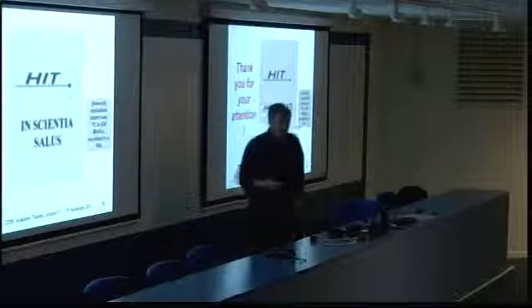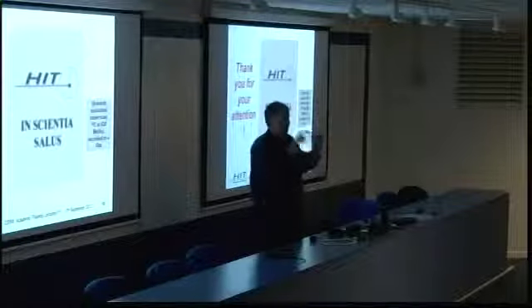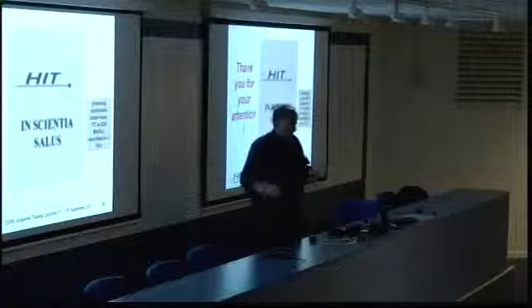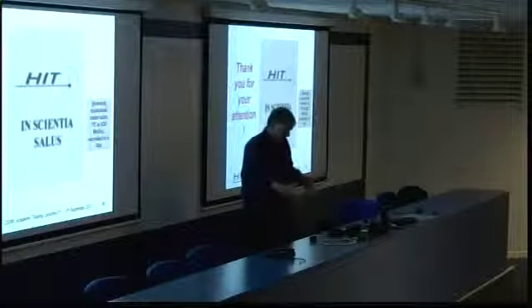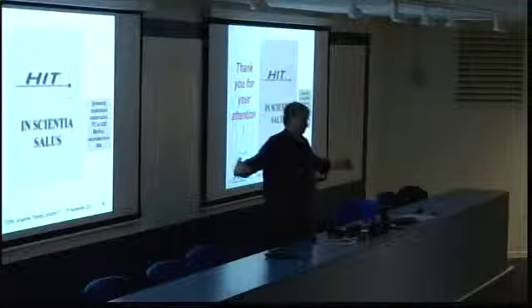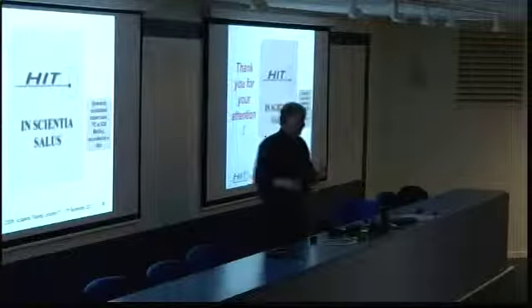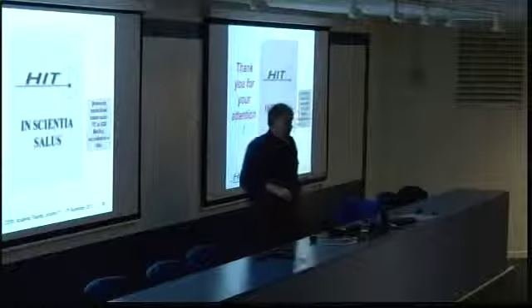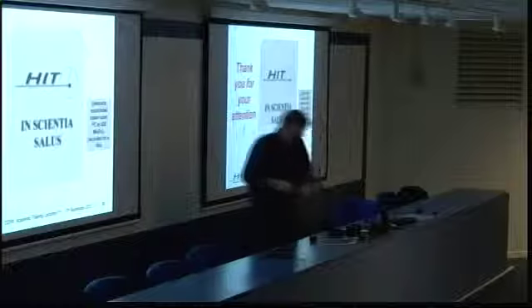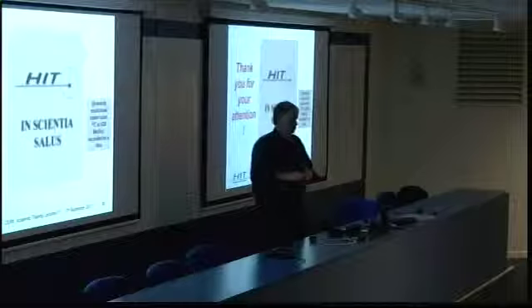The second story is the mechanical stability of such long, small and long things. Going back to the Linac, the IH drift tube Linac is very slim. It's only 40 centimeters in square and 4 meters long. Such structures tend to be weak and to not stay within 50 micron or something like that. As a gantry you may have to fulfill, let's say, 0.5 millimeter. So I think mechanical stability is a topic.